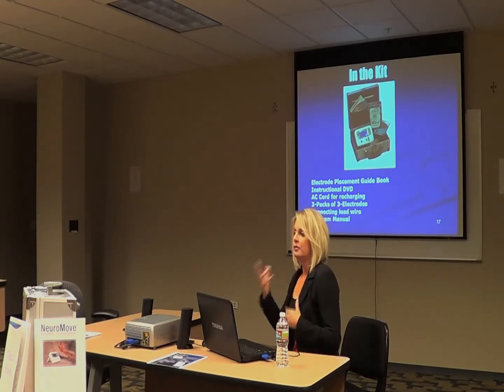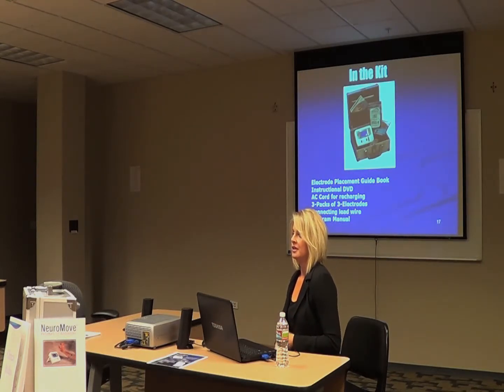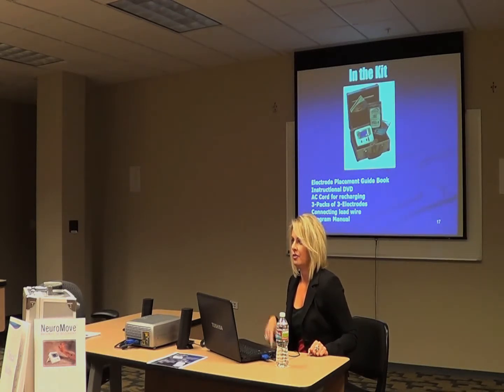So when you're working with patients and you're thinking about what do I have this patient imagine, a lot of times you just want to talk to the patient and ask them what they did before that they can't do now that they want to do again. And that will trigger all kinds of things for them to imagine that they want to do. When I have it on, I imagine spiking a volleyball because that's a real visual thing for me, and I can really get some good movement out of meeting the threshold.